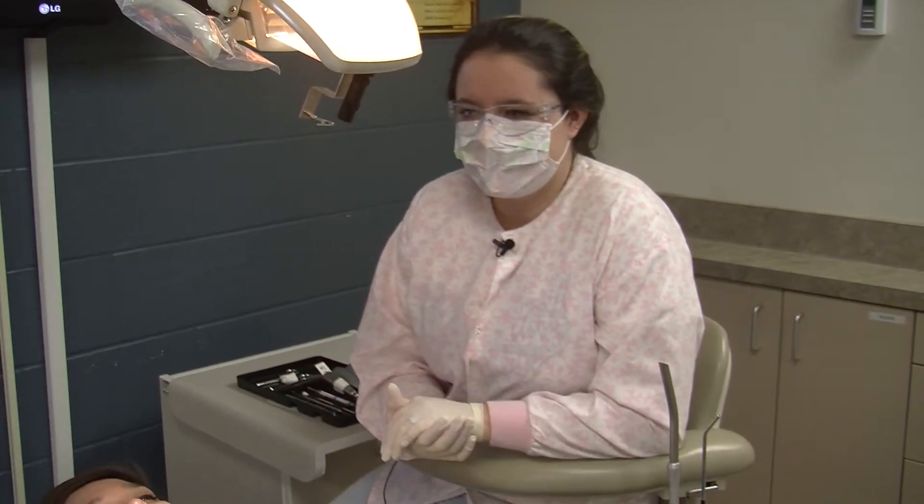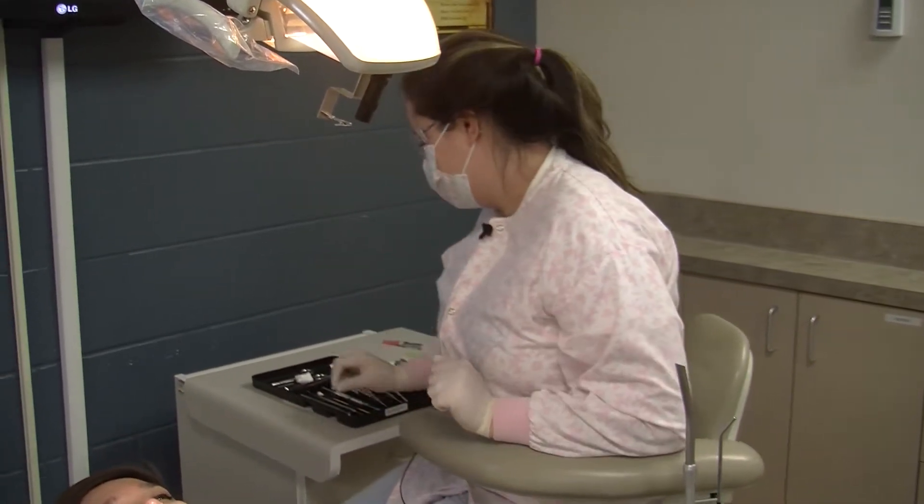Hi, my name is Ana Alicia. I go to Blissfield High School. I am enrolled at Dental Aid at the LISD Tech Center. Today I'm going to show you a simple extraction, but we're not really going to pull our teeth out. The instruments aren't sterile and she's kind of not feeling it.